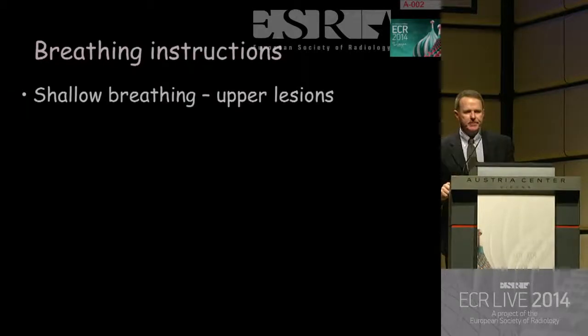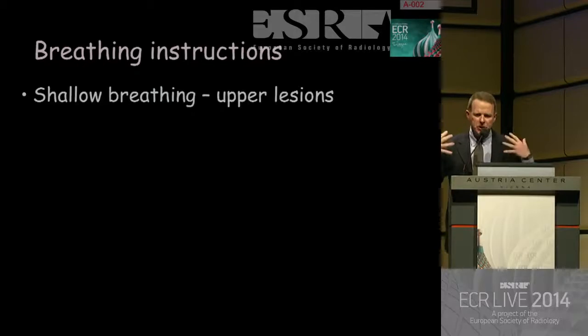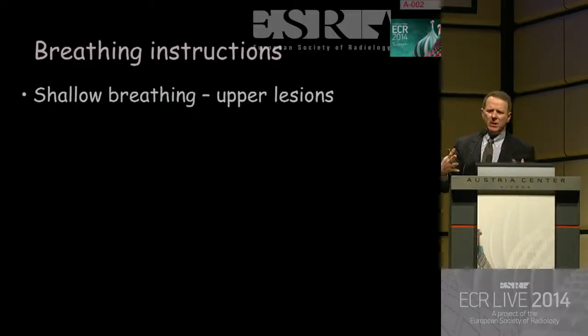Breathing instructions. First, position. Second, you know how much you have to communicate with the patient. Okay? They're awake. You're going to get only local anesthesia.